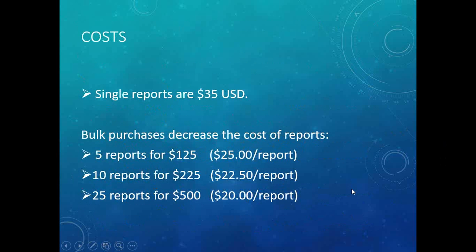So what are the costs for using this particular feature? Well, if you want to just explore it once or use it sparingly from time to time, you can buy a single report for $35 US, but we intentionally want to make this much lower cost so that people can actively use it, and so it's not such a burden for them. And so if you buy reports in bulk, the cost really comes down to about $20 per report. So it makes it very easy to have this quick, simple summary for you and your client available at not much cost at all.